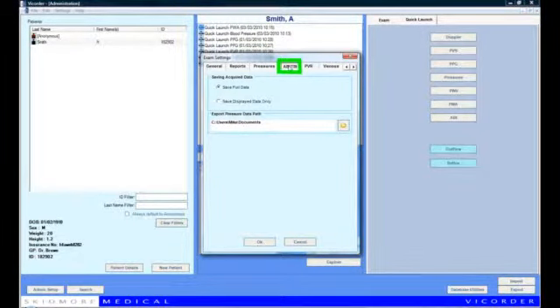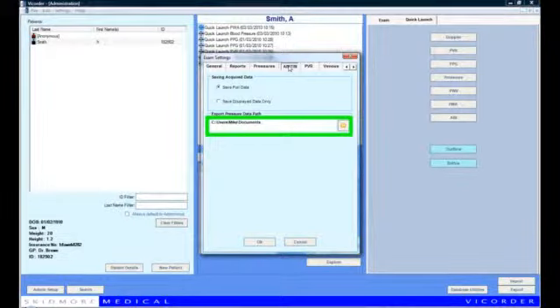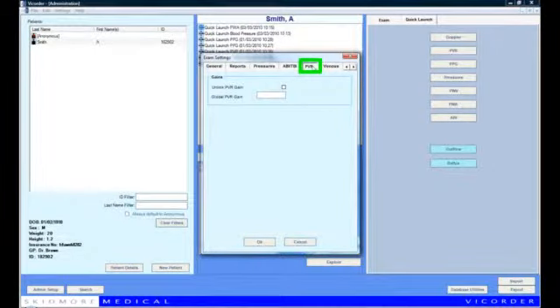Under the ABI/TBI tab, you can choose between saving the full data set or just the displayed pressure data and specify a file path for the saved data. Under the PVR tab, you can unlink the PVR gain controls by checking the box and specify a global PVR gain.